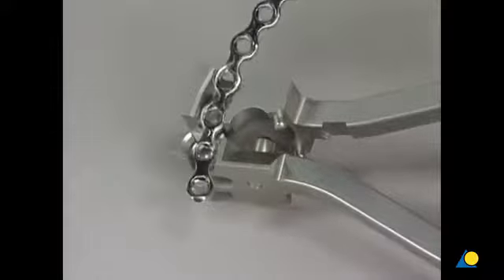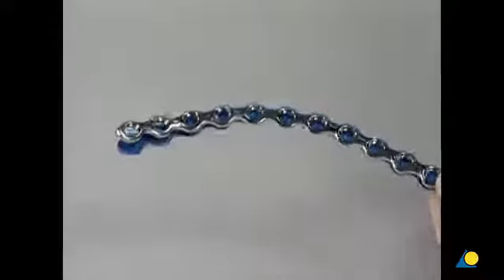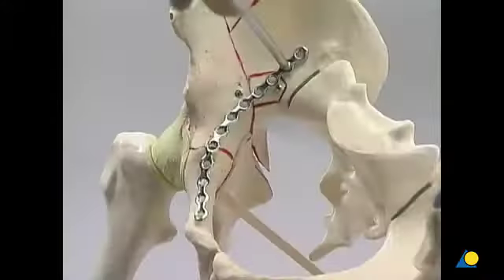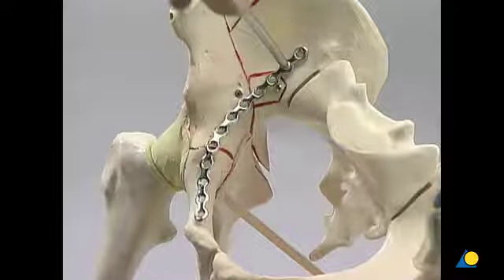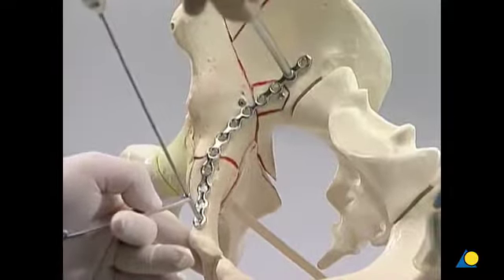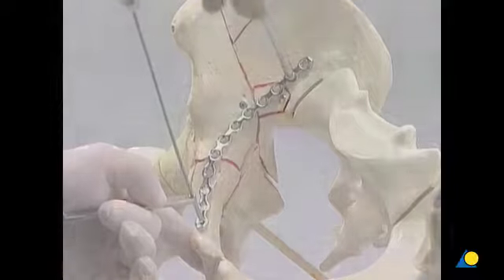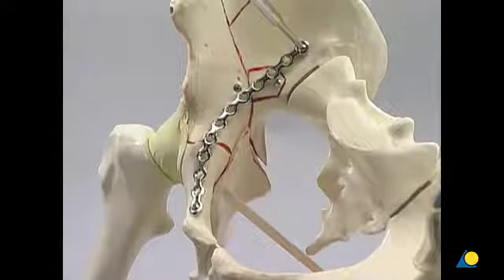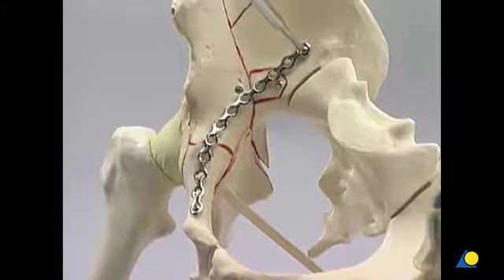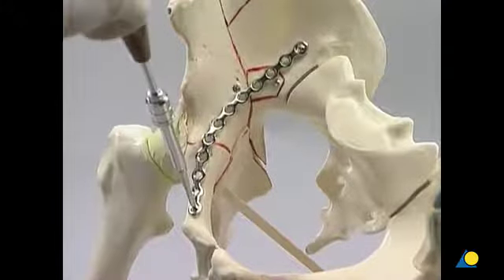The curvature of the plate is adjusted by bending along its longitudinal axis. After the plate has been contoured, its profile is checked against the template. The plate is laid on the pelvic brim with the proximal end held in place using the ball spike. At the distal end, the plate position is adjusted and the plate is fixed in place with a 3.5 mm screw. After adjusting the plate position in the posterior aspect of the pelvis, a 3.5 mm screw is inserted parallel to the sacroiliac joint. The distal screw is secured.